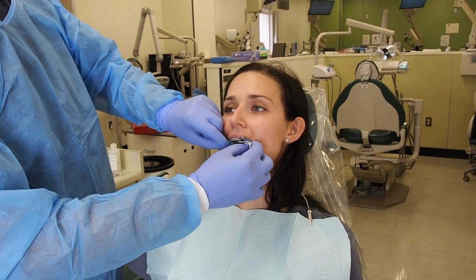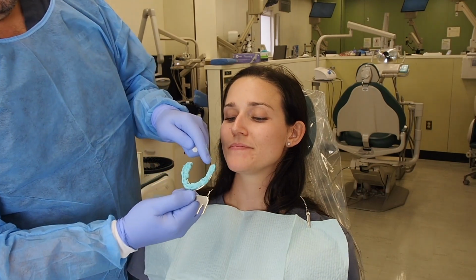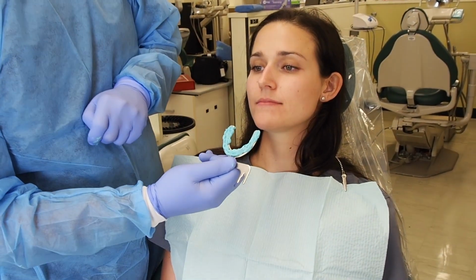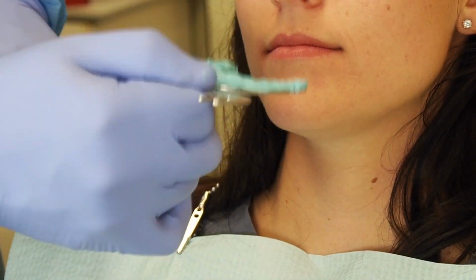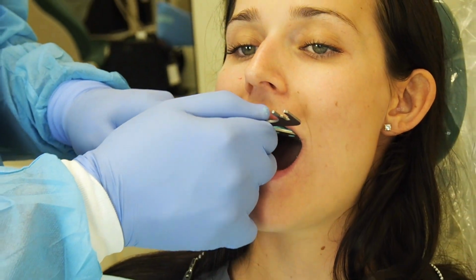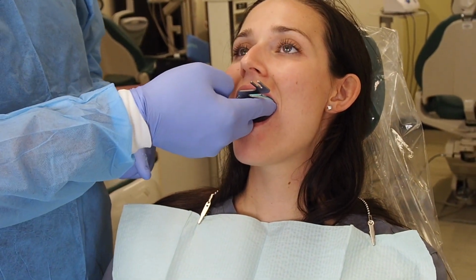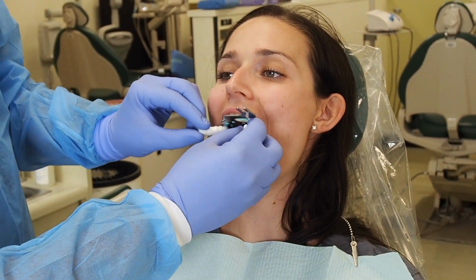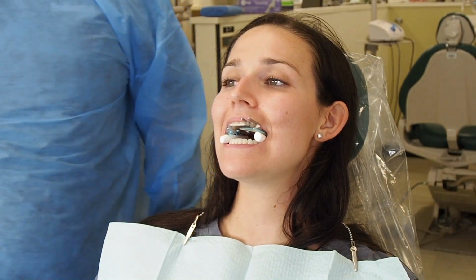I'm gonna take it out right now, just to show you what it is that I'm looking for. I'm looking for a trace of the occlusal surface on it that will give me a good stable position of where these teeth are going to, or where the upper cast will rest, right? Bite down for me. Now this is staying nice and good.